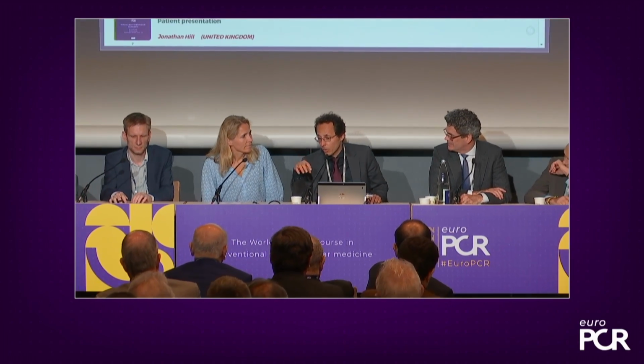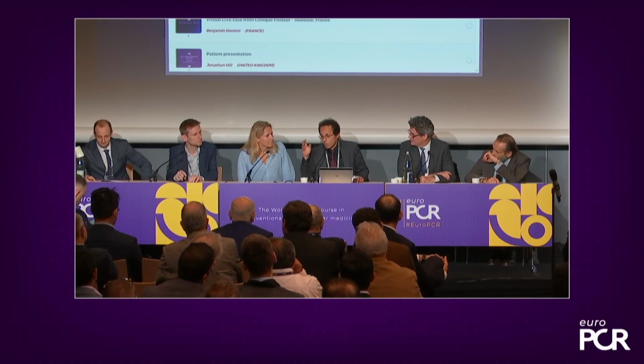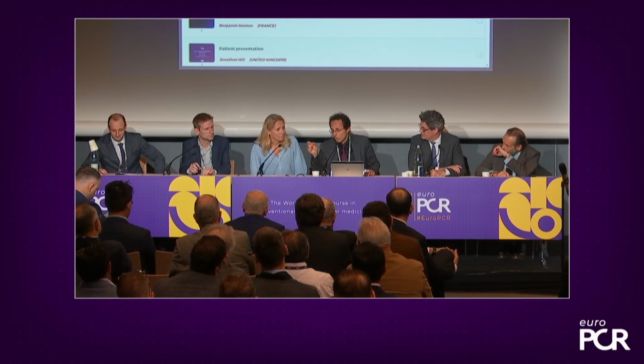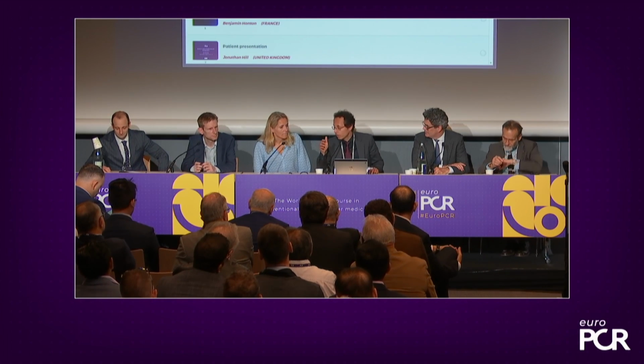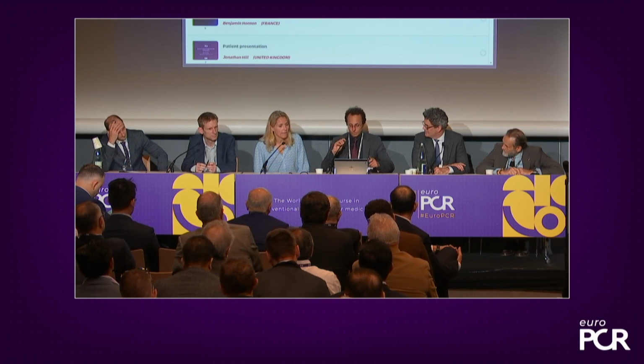No, you mean just by the ring or the whole length? No, I mean, if you have only one isolated ring calcification where the non-compliant balloon does not open, do you think it's also a possibility to crack it? Or do you think that the emitters are too far away to crack it? Well, this is also when you should move your balloon back and forth, right? So you will emit your pulses in different areas.